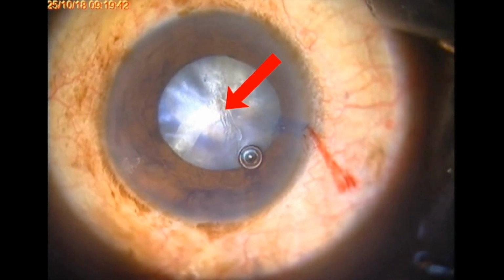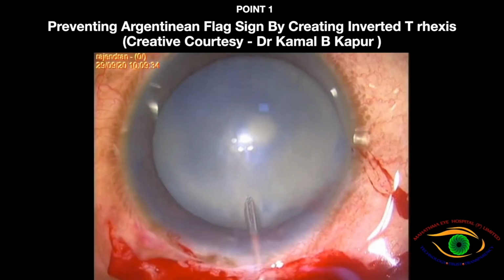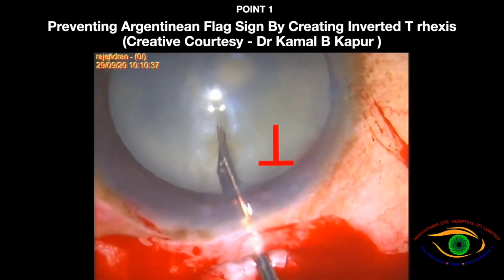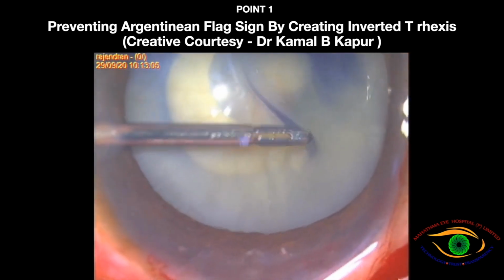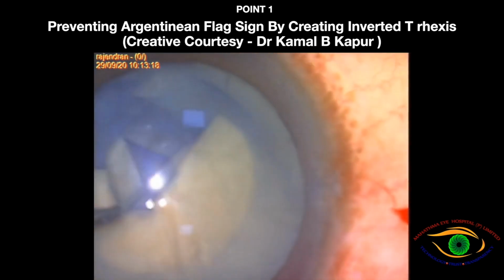The following points can be kept in the mind of neophytes while encountering and preventing the Argentinian flag sign. Point 1. Preventing Argentinian flag sign by creating an inverted T-rexis. The intralenticular pressure of an intumescent cataract can be reduced by injecting a 26 gauge needle faced bevel down and performing a graded suction with a glass syringe. The idea then is to perform two hemicircular rexes with two flaps, one from the clockwise direction and the other from anti-clockwise direction. So, in scenarios where one flap extends to the equator, there is always another flap present for achieving and completing the circular rexes.